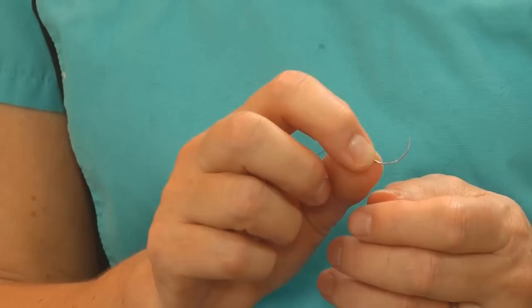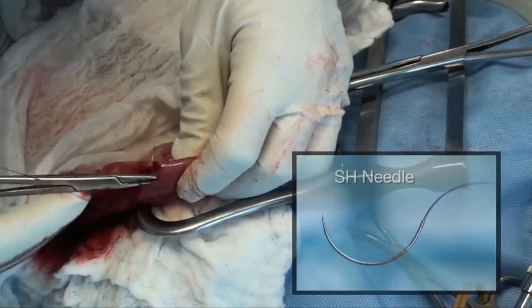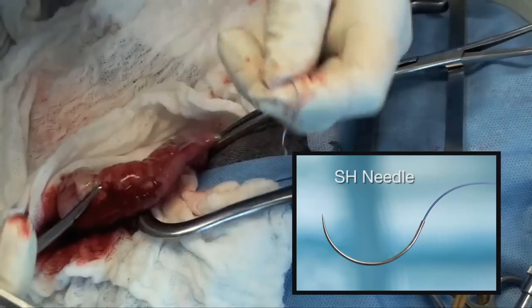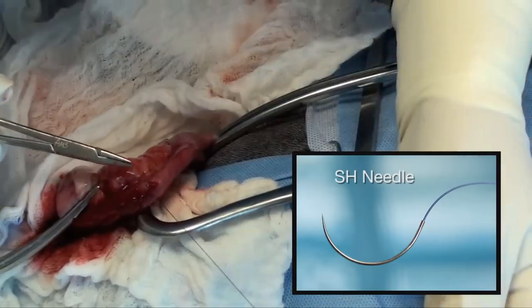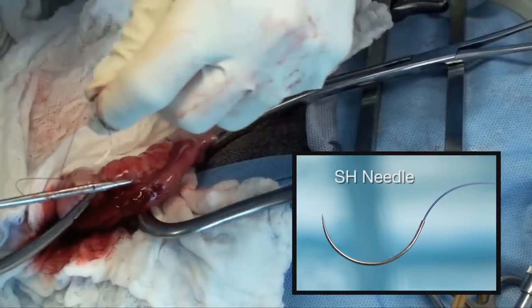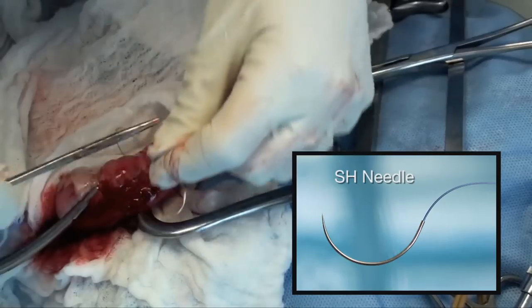I like to use the SH needle on the bowel. It's the appropriate size — SH refers to the size of the needle. There's not too much needle; it's small enough that with my needle driver, I can easily control the point of the needle and guide it through the tissues that I want it to go through.